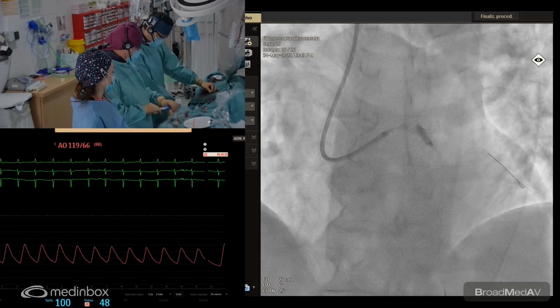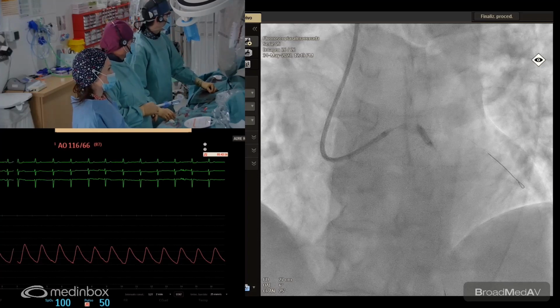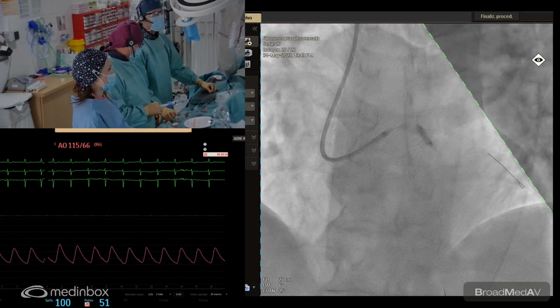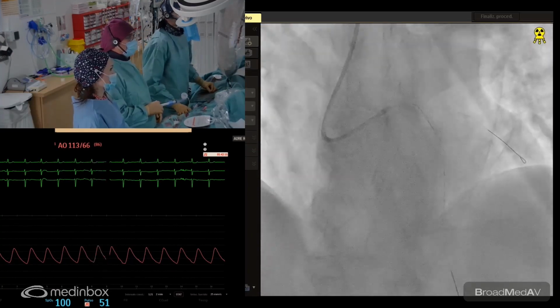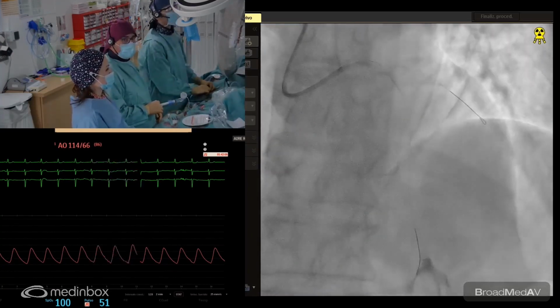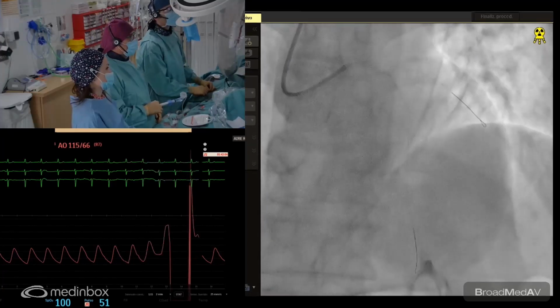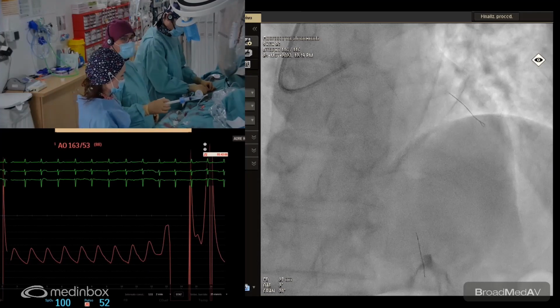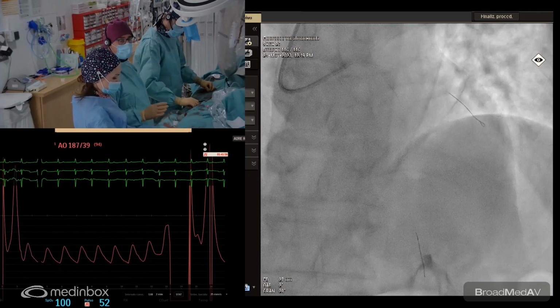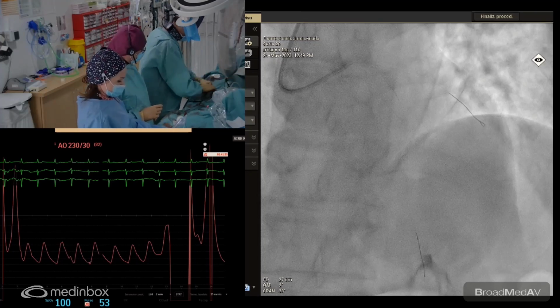Let's check how was everything. Also the side branches. And decide the stenting, no? Is the landing zone 3.3, no? Test, please. Yeah, the distal landing zone is 3.0. I think all the side branches are there. And the length, do you remember? The length of the stent is.